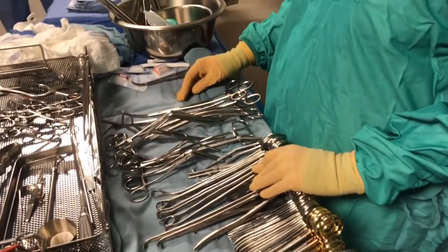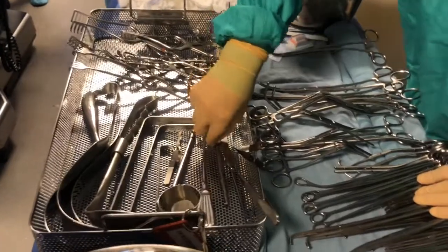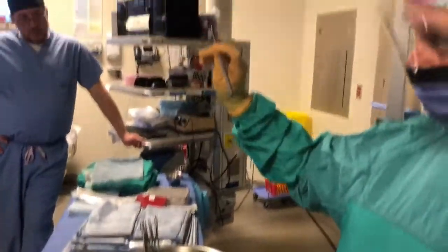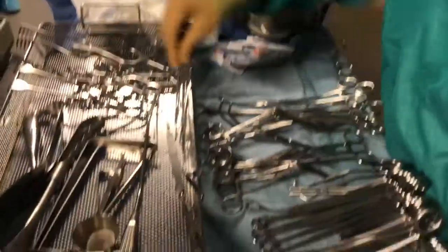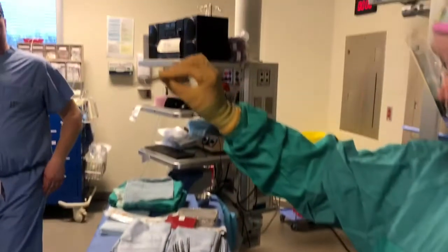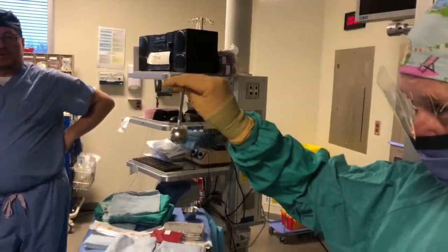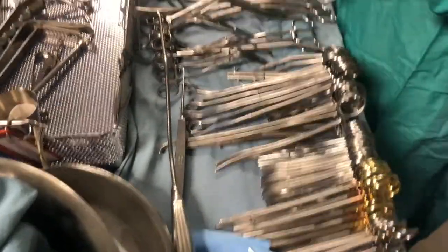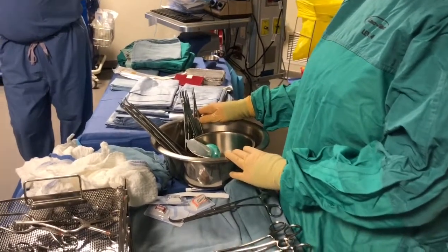Yeah, it does. Okay, so then I have Penfield. I'm sorry. Penfield. Okay, I have a nerve hook. I have a compression clamp. Now these hemoclippers won't be in the vascular, they'll be in a different section, so you have to find them.